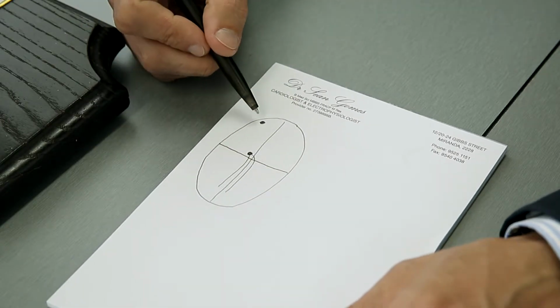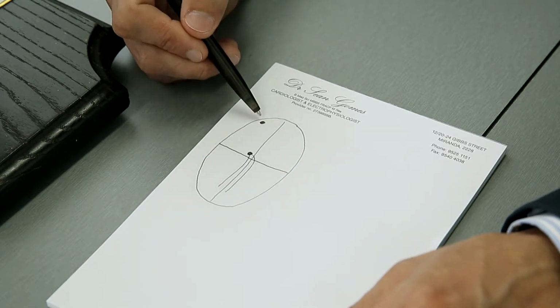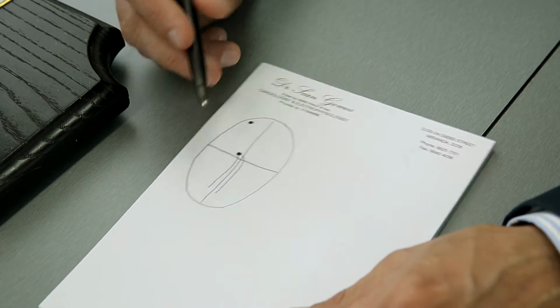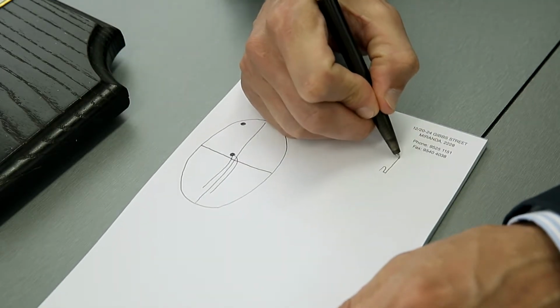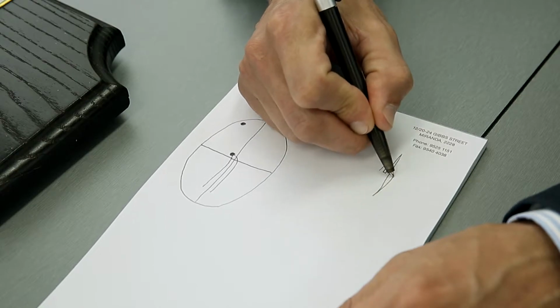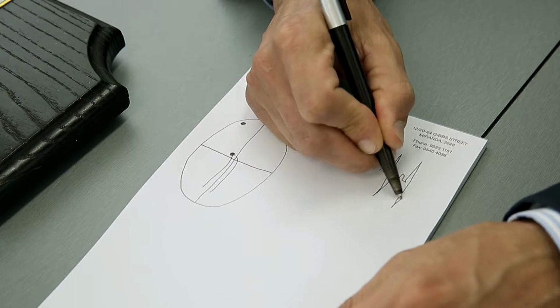The normal activation of the heart will be from the top down to the bottom, top and then the bottom. And on an ECG, what we see when we do a cardiograph is activation of the top and bottom. This is called normal sinus rhythm.